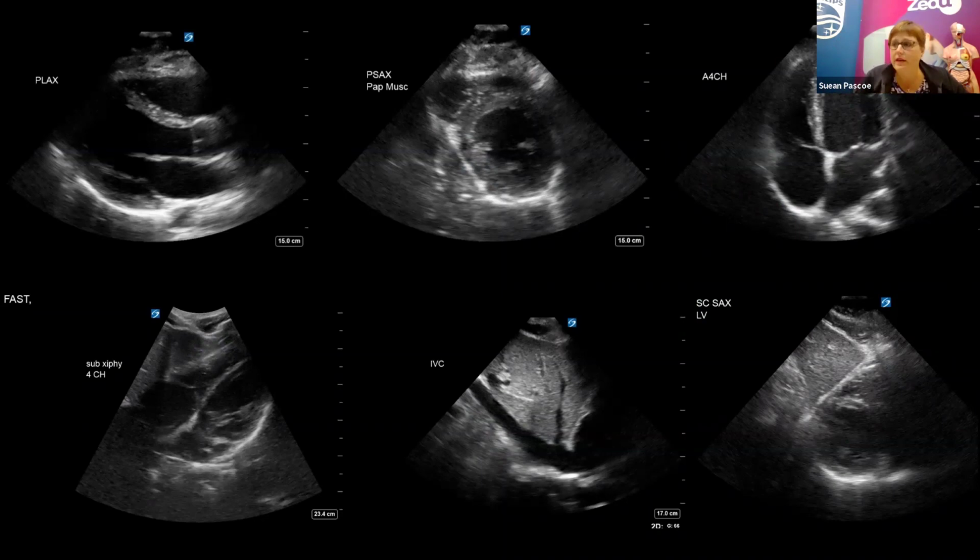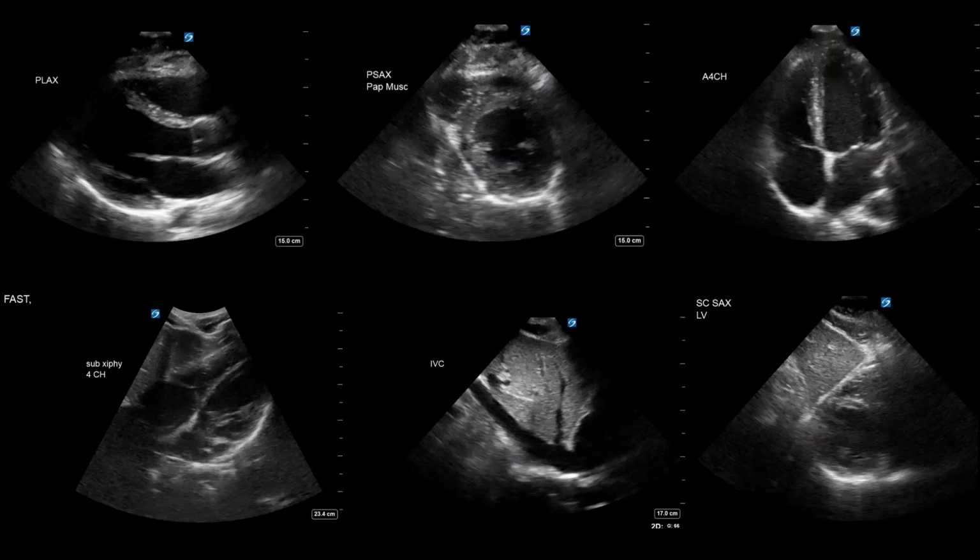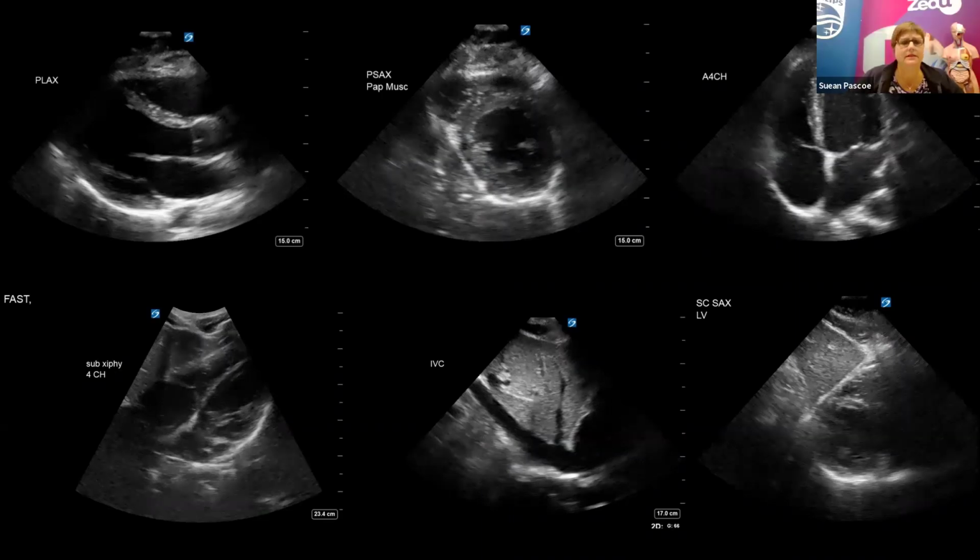So the other thing that we do for anyone who is having image review with us and that we're mentoring is we give them an example of an exemplar. And these are really handy so that people know what to expect. So this is a series of pictures in an ideal patient that have been documented with appropriate depth and gain settings and stuff like that. This is what a perfect exam looks like.